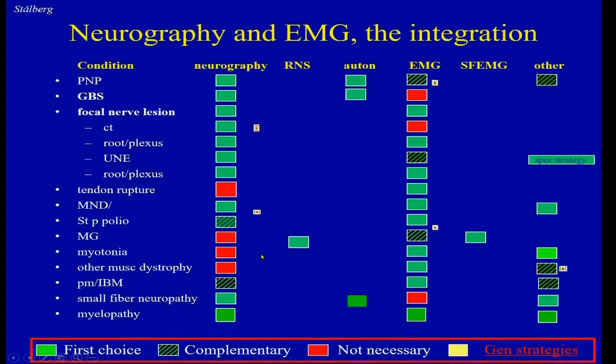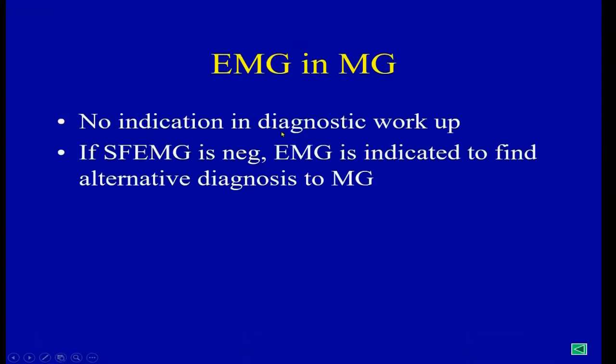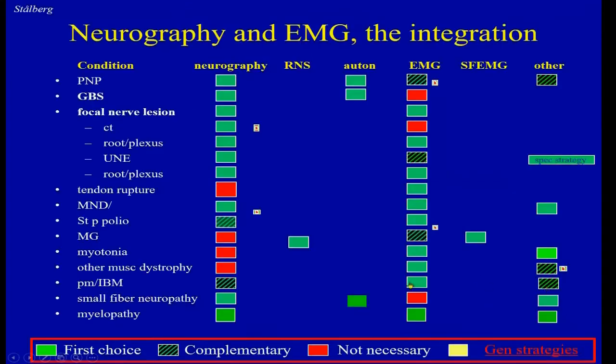There is no primary reason for EMG, and certainly also not for an ordinary neurography.